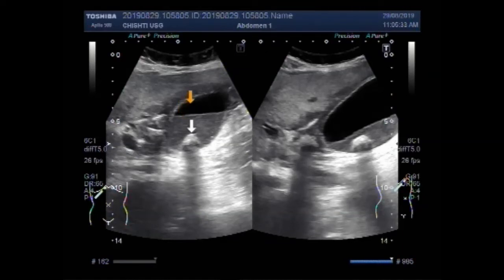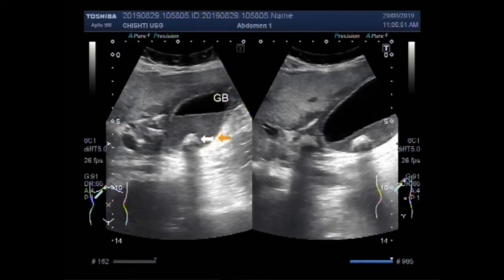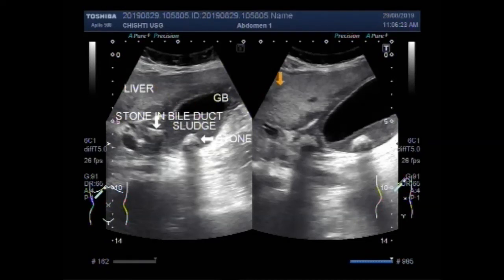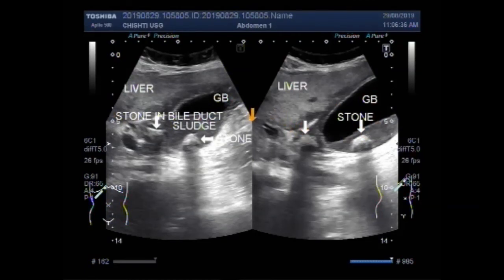This is the stone in the gallbladder. This is the sludge. This is the stone in the bile duct. This is the liver; this one is also liver. Now this is the gallbladder and this is the stone in the gallbladder. This stone lies in the proximal portion of the bile duct.